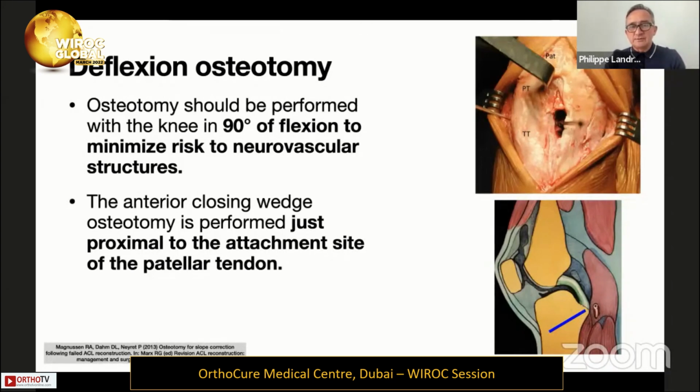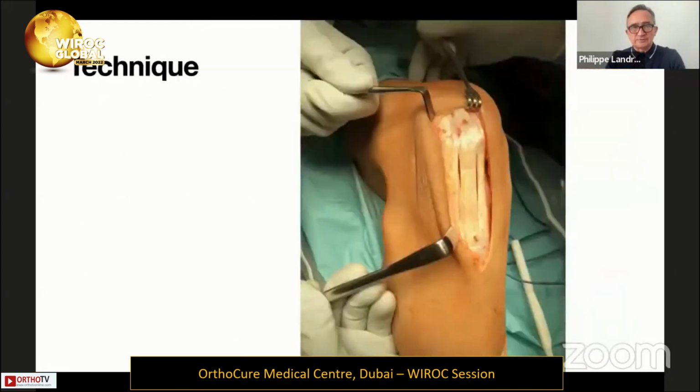The anterior closing wedge osteotomy is performed just proximal to the attachment site of the patellar tendon. There are different techniques, but this technique allows good compression and good stability of the osteotomy. This is a technique I learned with Philippe Landreau from the Lyon School that you know.